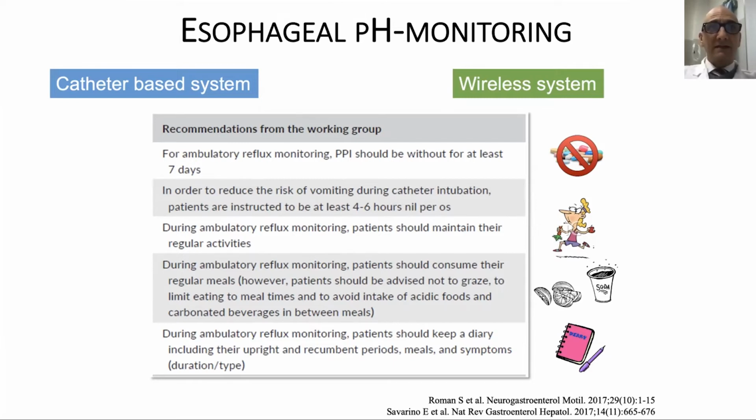We even ask our patients to exclude orange juice, soft drinks, or carbonated beverages between meals, and patients should be instructed to correctly report their symptoms and duration, and describe the time of meals and overnight rest.